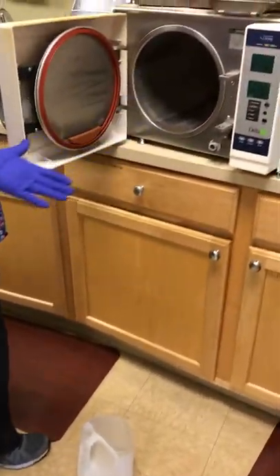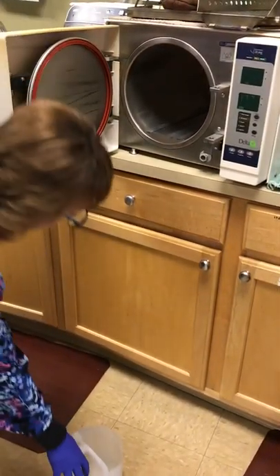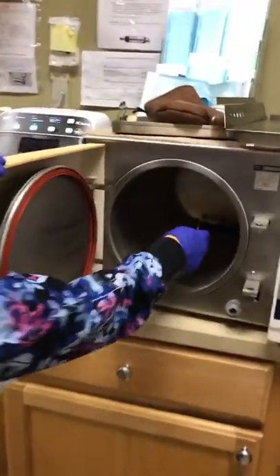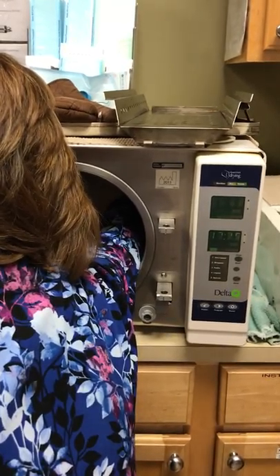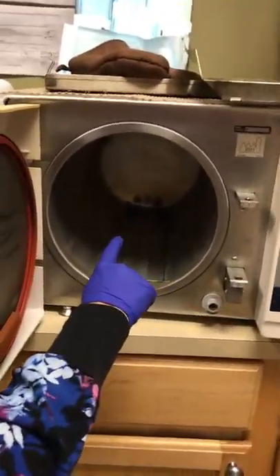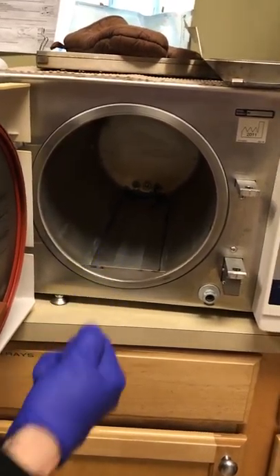So you start off in the sink and then go into the container. Take everything out of the Delta Q, and put this back in. There's a light on there. That little copper tubing in there — we're going to pull that out.